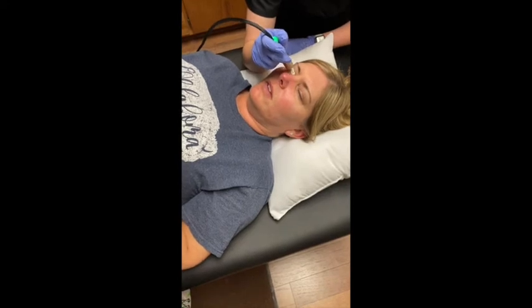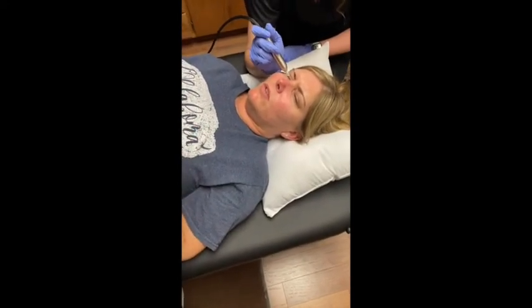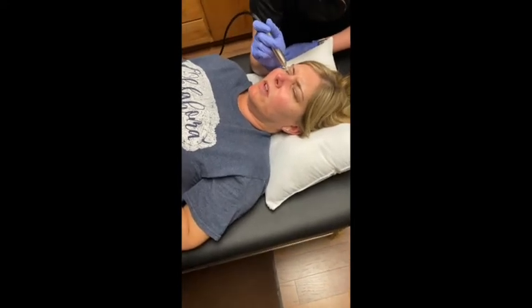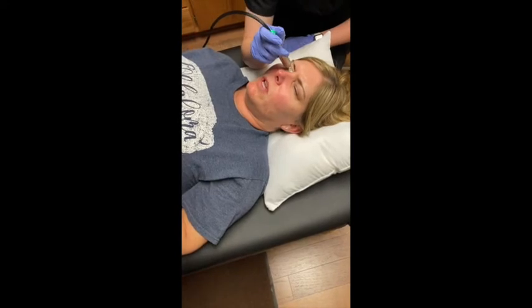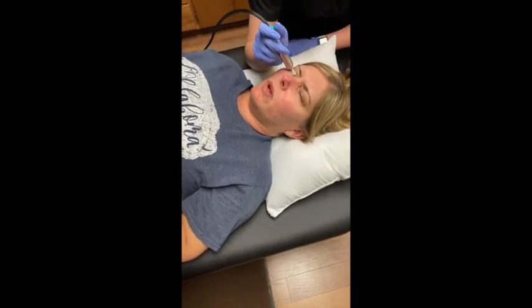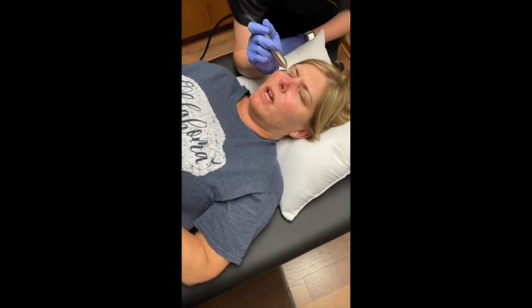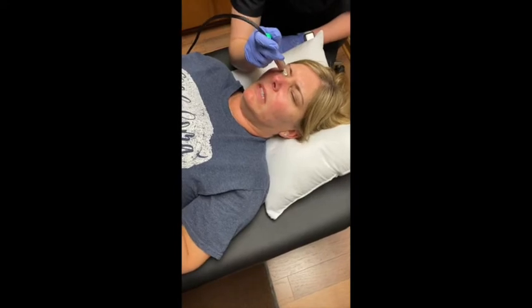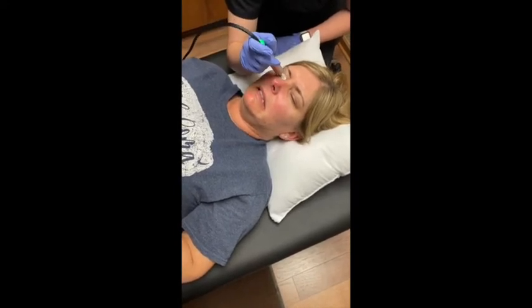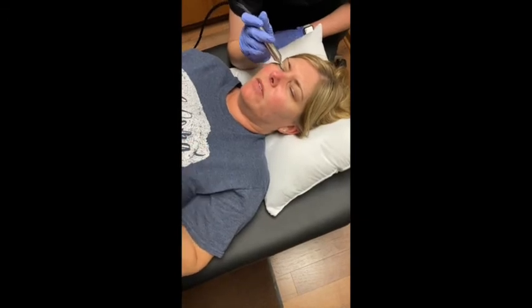Yeah. Now, is there like a cream that I need to use in between treatments? No. Just, what is safe for me to clean my eyes with when I take my makeup off? So the makeup remover is good. You just want to make sure you get all of your makeup off. And if you can, try not to use an oil-based makeup remover. Because what'll tend to happen with the oil-based makeup removers... I have Clinique oil-based remover that I pay a lot of money for, that stuff, so I'm giving it away.